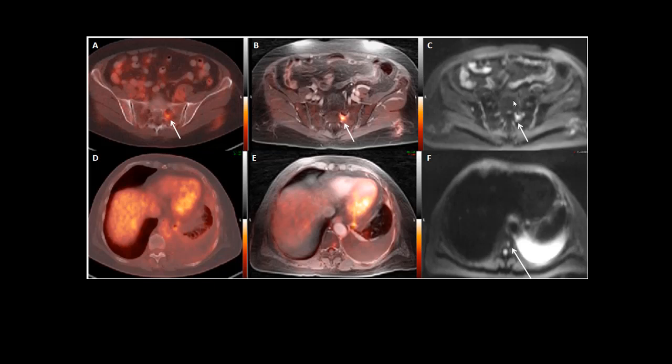Just look at an example here. This is a fused PET CT where we see a sacral lesion here. On a T1 weighted MR image fused to a PET, you again see the same lesion here. And on a diffusion weighted image again, you can see a left sacral lesion. In the same patient, there's another lesion there. And on a fused PET MR, you can actually see that lesion in the vertebral body here, again, on a diffusion signal here. In retrospect, it's probably there, but it was difficult to see on a PET CT.